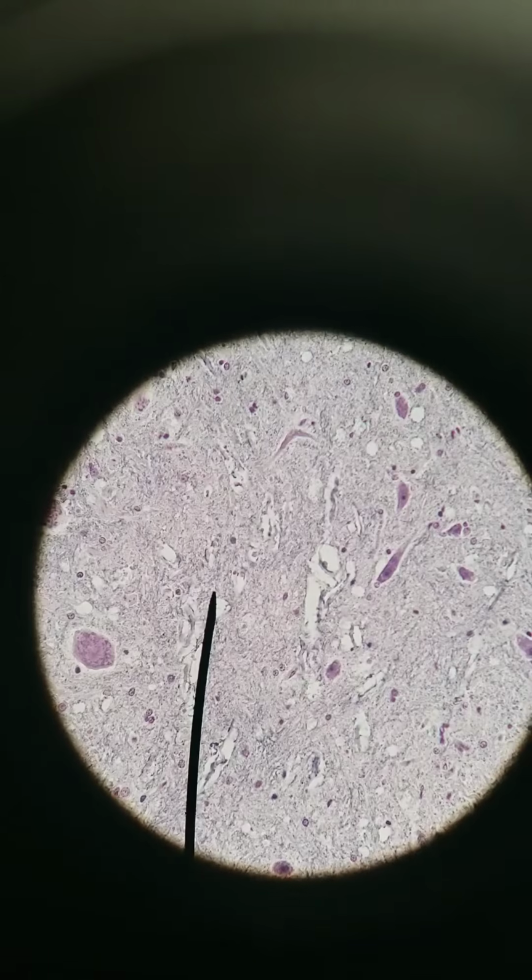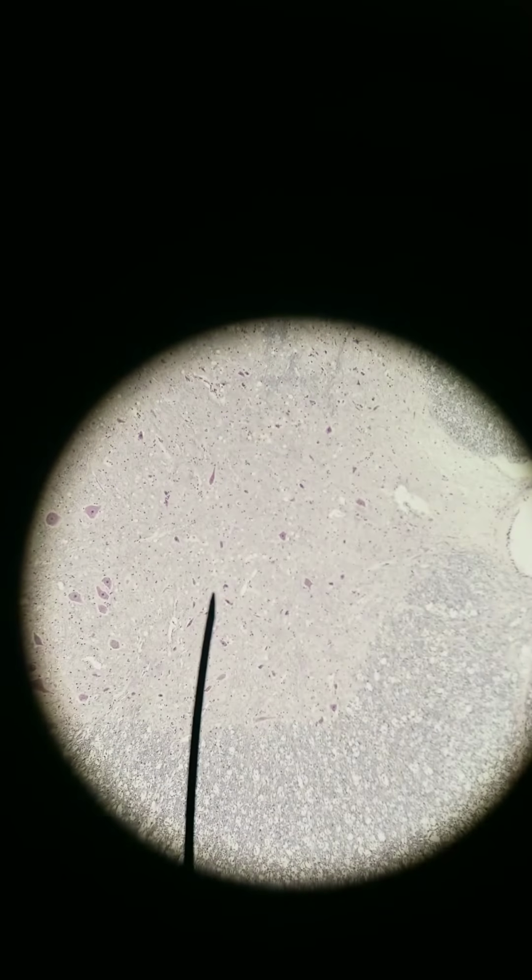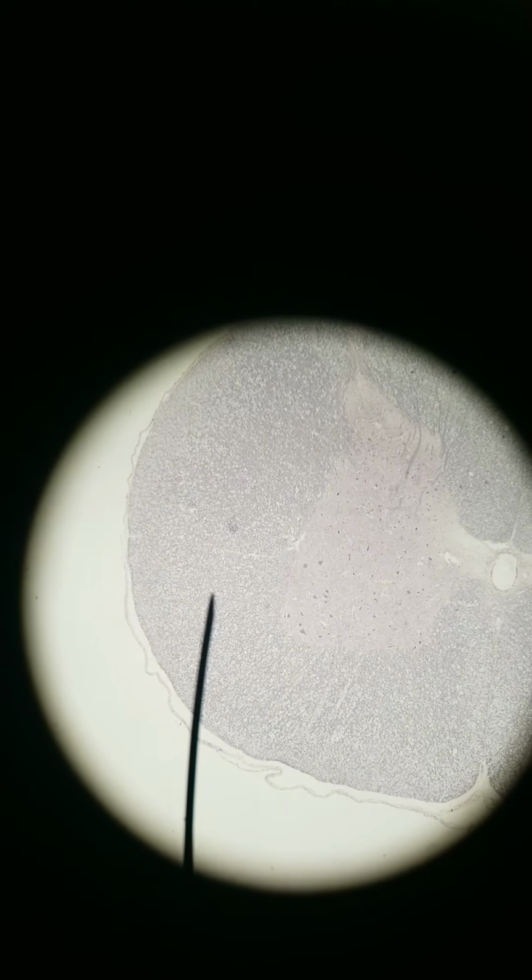They could be other types of interneurons, but well, they're motor neurons if they're in the ventral horn. So this is the bottom part of that gray area, going back to 40X. So down here, these would be motor neurons, and then these are other interneurons like sensory interneurons. But they're all multipolar. They're in the gray matter of the spinal cord. Out here, these are axons in cross-section in the white matter.